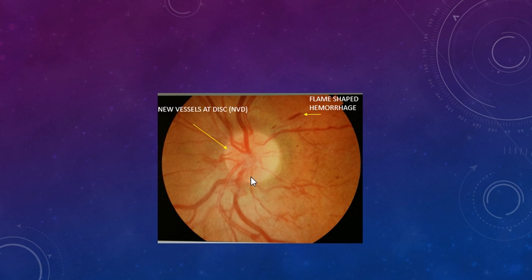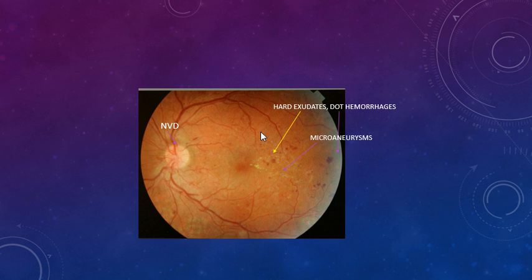Sometimes it may be difficult to pick up new vessels at the disc and differentiate them from collaterals, which can occur in patients with vein occlusions. In such cases, fluorescein angiography is very helpful — it shows significant leakage in the case of new vessels, whereas collaterals do not show much leakage. Another image here shows dot and blot hemorrhages with some exudates in the macular area close to the fovea — this is very close to the central area, so the patient is at risk of losing vision due to maculopathy.